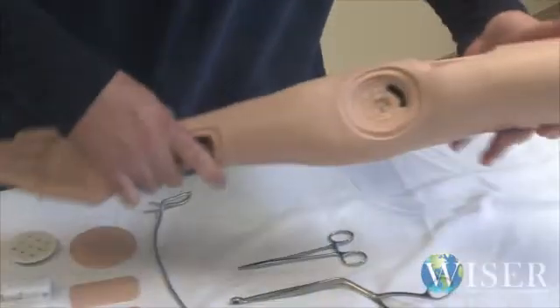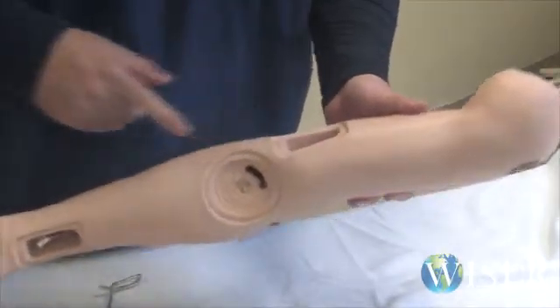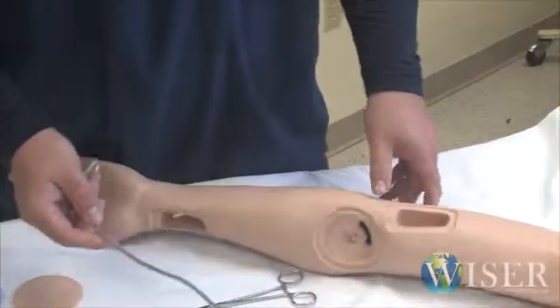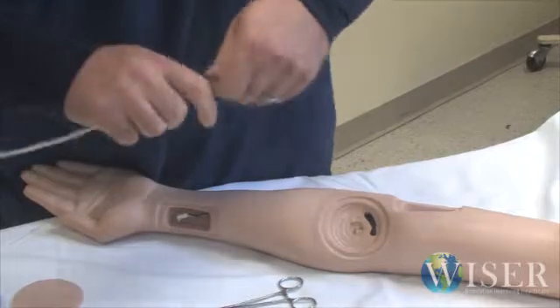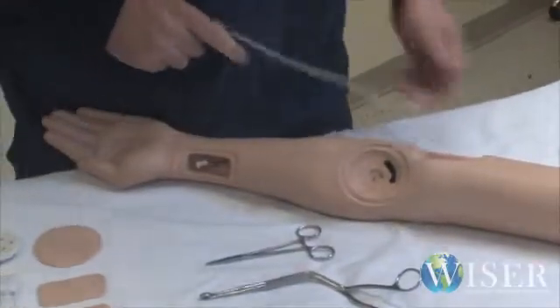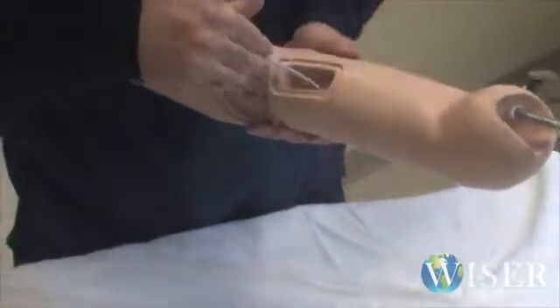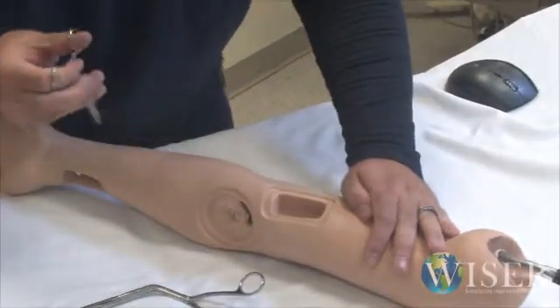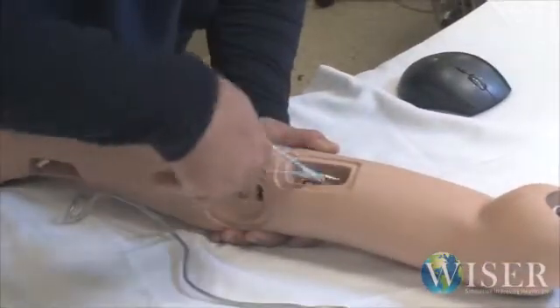So then you want to go down, starting at the top. It makes things easier if you start at the top and start pulling through your different connections. And this is where the stylet really comes in handy because it's flexible and it makes it just a really easy tool to find your wires. So I just kind of make it a hook and go fishing. And once I kind of see it, I go in with the hemostats. Then I get it through. So you got your first one through.